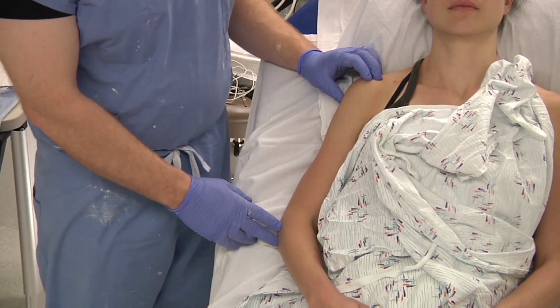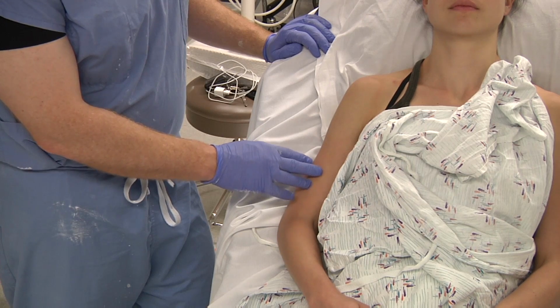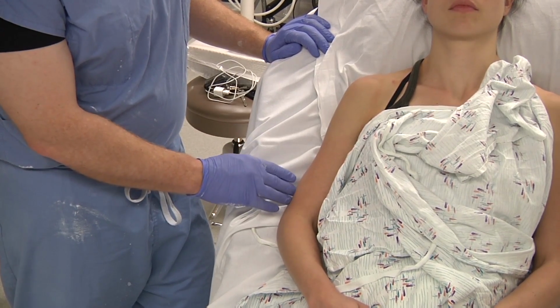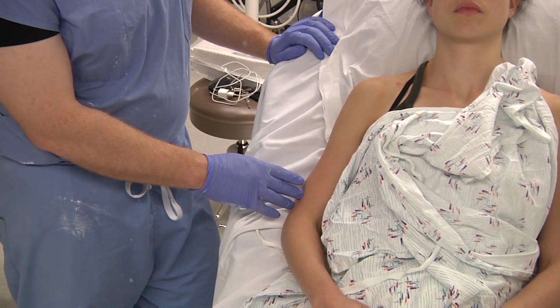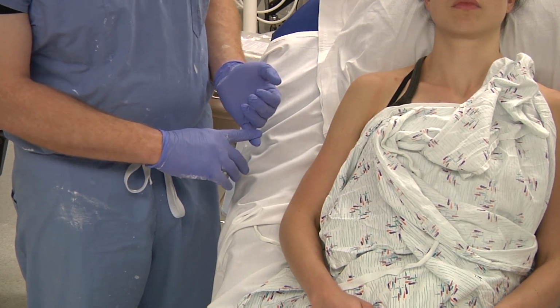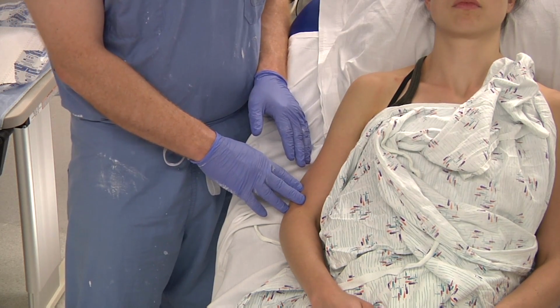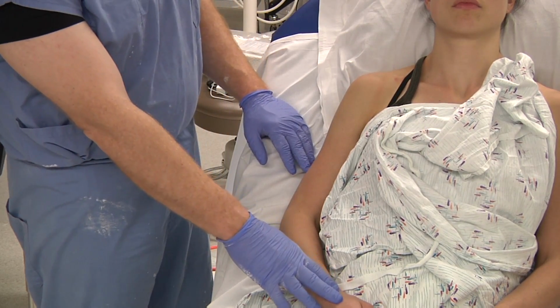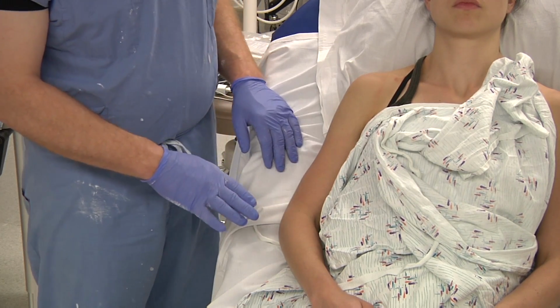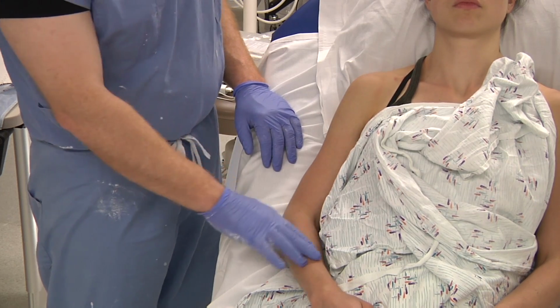if you're not putting the patient directly into a specialized abduction brace with an abduction pillow. Next, we're going to be applying a coaptation splint. This is commonly used in mid-shaft humerus fractures that are displaced or angulated. As always, it's very important to make sure you have appropriate neurovascular exam, especially in the setting of a Holstein-Lewis fracture or a distal spiral fracture of the humerus. Making sure that the radial nerve is intact is especially important, as that is well documented to be a potential complication of that fracture. Also check vascular status.